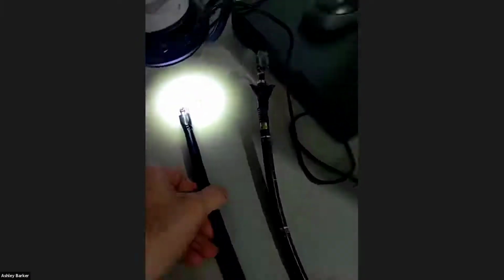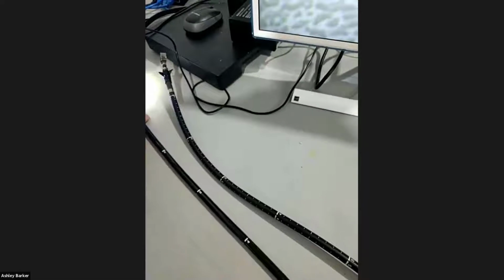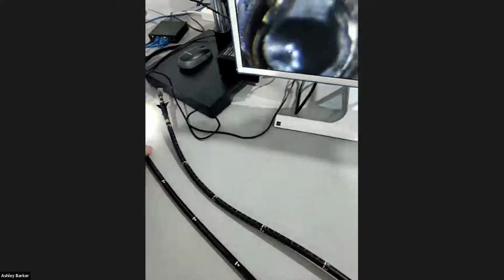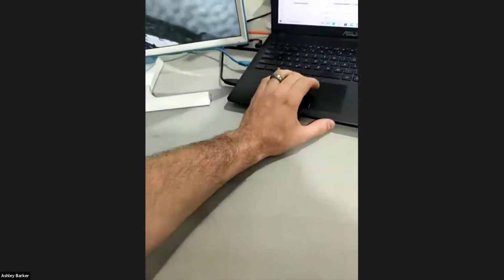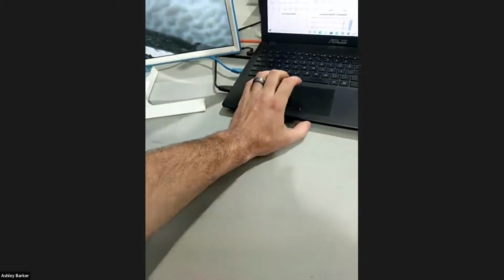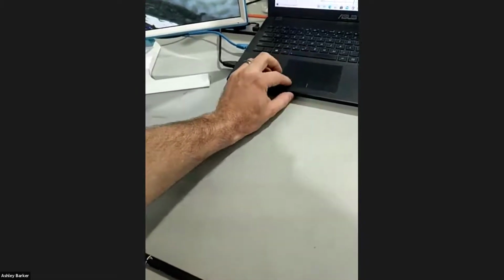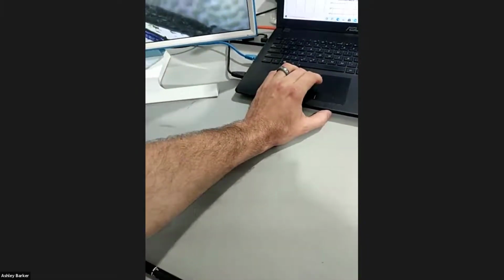I won't unplug that yet. Let me just go around to here. Is that still spinning? Hang on, sorry, just give me a second. That stopped spinning. Let me just start the test again. Oh, here we go. It's sorting itself out. Sorry about this.